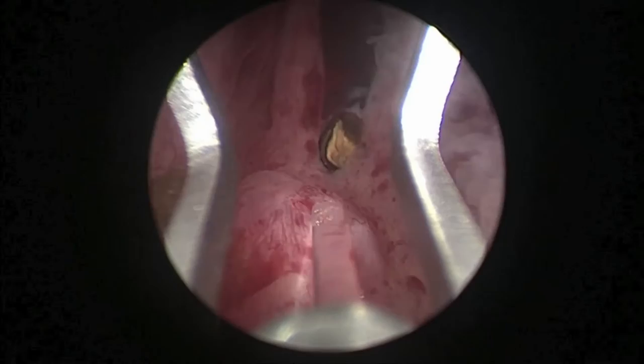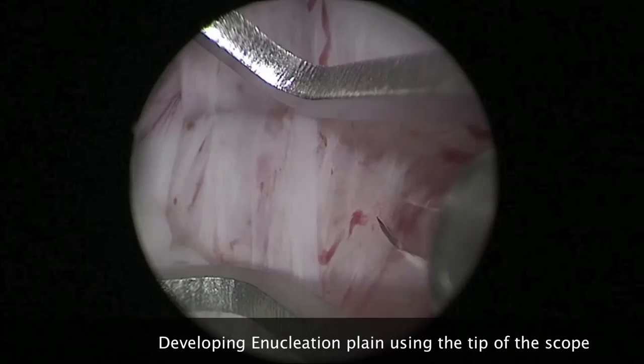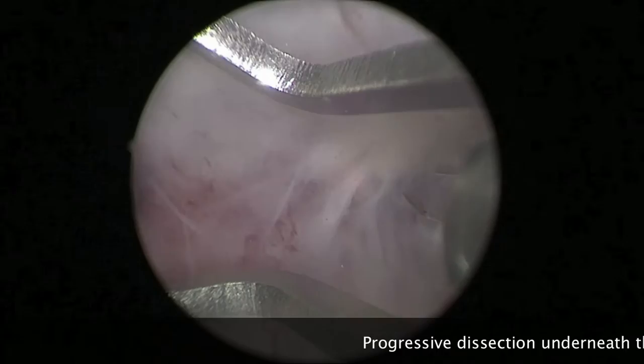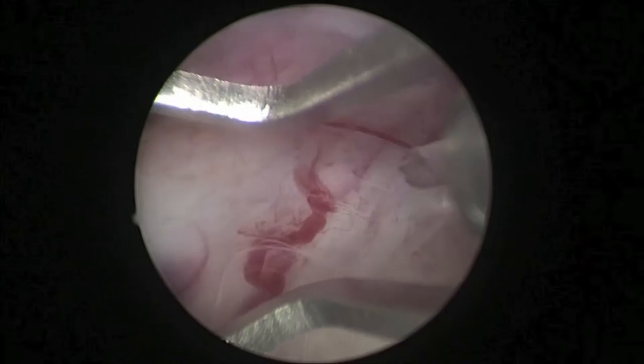The scope is tilted and the mucosa is incised lateral to the verumontanum. Then, developing the enucleation plane using the tip of the scope is planned, with dissection underneath the enucleated adenoma. Progressing the dissection underneath the adenoma continues. It is a laser-assisted procedure. The adenoma is put under tension and the laser beam is used to dissect any attachment between the adenoma and the surgical capsule.